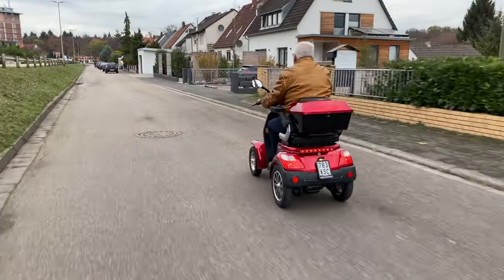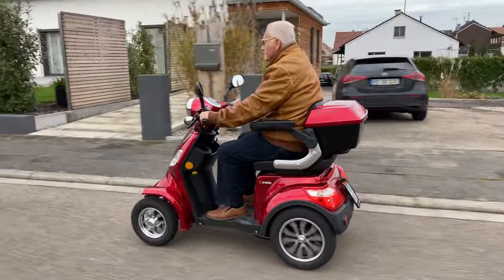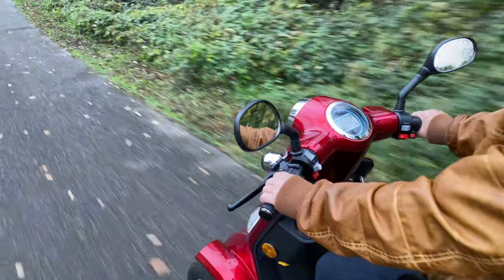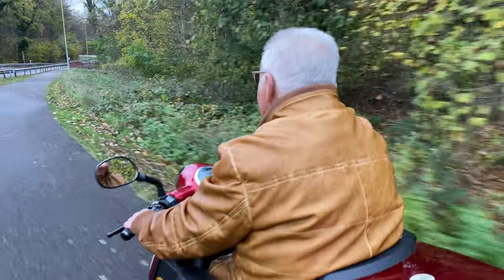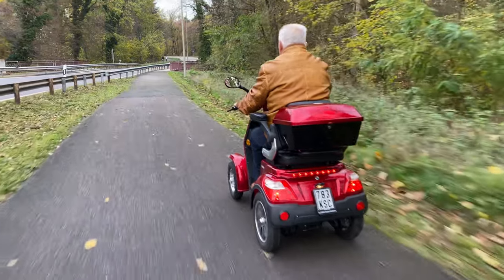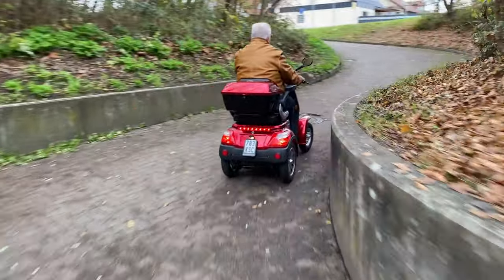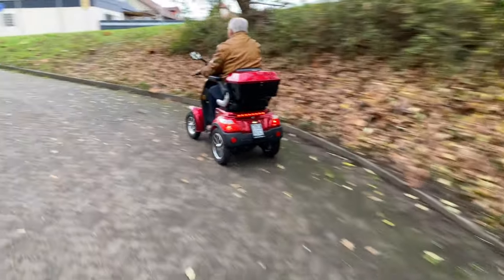However, if you choose a model that doesn't have a seat belt at all, the only option left is a helmet. This requirement — helmet or seat belt — is not necessary at a top speed of only 20 kilometers per hour. My opinion is that 20 kilometers per hour is completely sufficient. The Luxon is a four-wheel mobility scooter which, in contrast to a three-wheel version, has the advantage of being more stable when cornering. It can practically not tip over and thus offers increased safety.